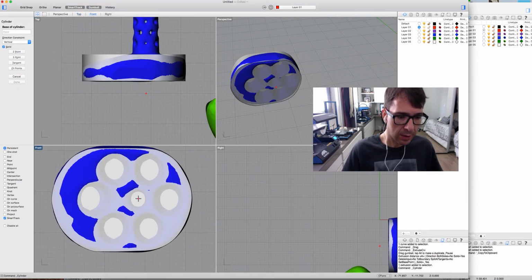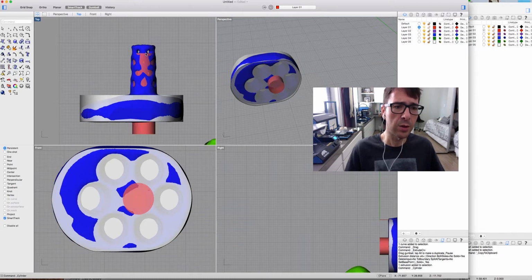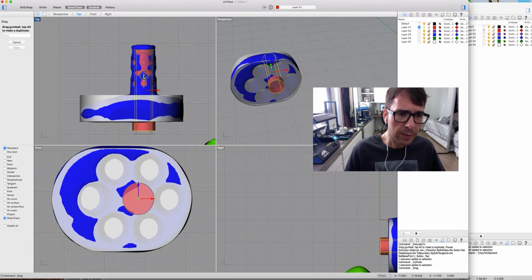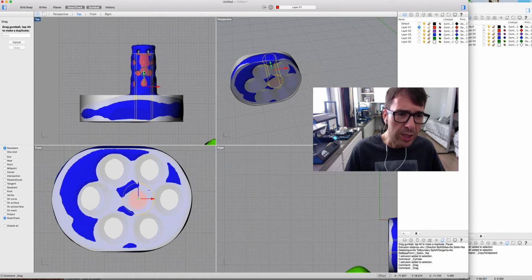This is the center of the peg. Okay, let's go over here. I'm not so sure about the diameter, but we can adjust it later. There's no problem. So here we have the diameter, the length of the peg, just as in the correct length.